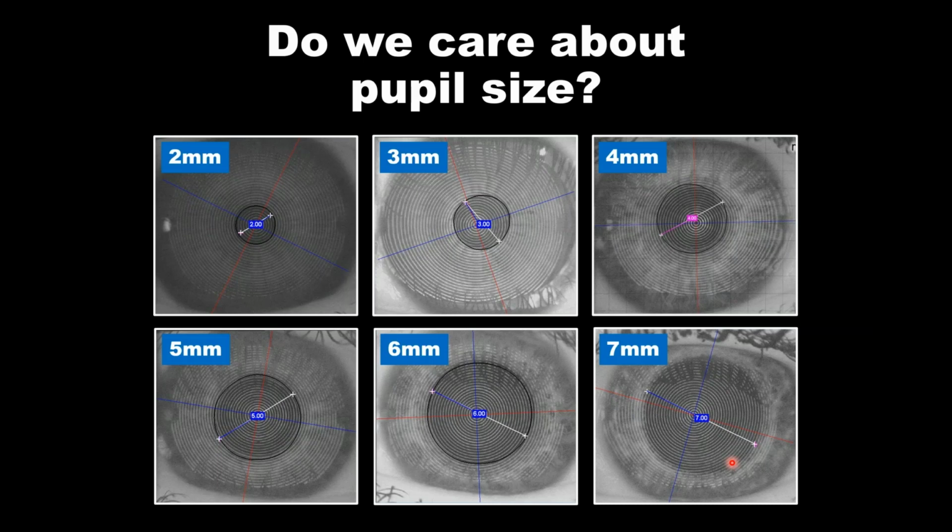If we have an exceptionally small pupil and we're trying to deliver multifocality to a presbyope, we have to make sure that the power we want to provide is within the pupil margins. For instance, if we have a multifocal lens where the most plus kicks in at 4 millimeters and we have a 3 millimeter pupil, then we're probably going to have a problem.